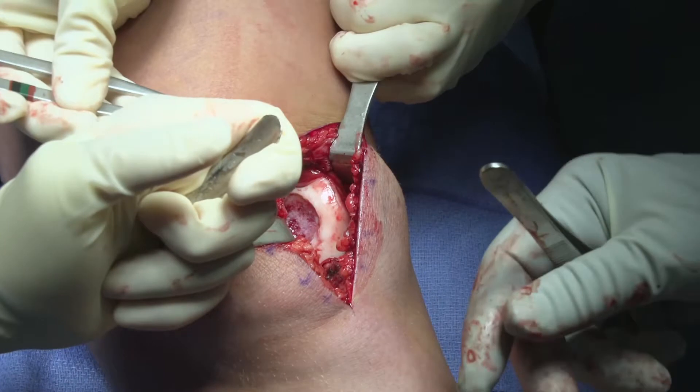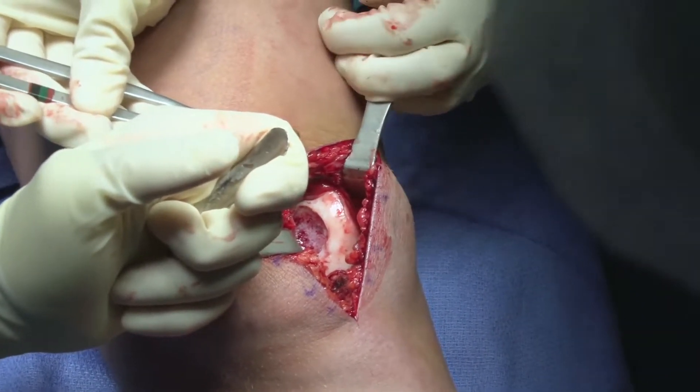With respect to various pearls that we've learned over time, it's still critical no matter what cartilage technique you use that the defect is prepared properly — that's as important as the technology you're using. The instrumentation creates vertical walls, which is really critical to get an abrupt transition zone between the defect and the surrounding normal cartilage. Respecting the subchondral plate for surface treatments is also really critical, so we are very careful in the defect preparation in that regard.